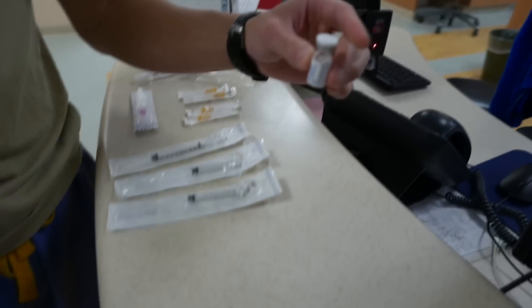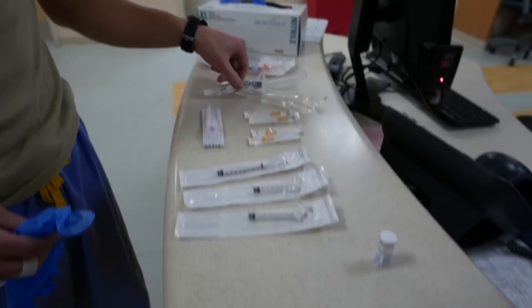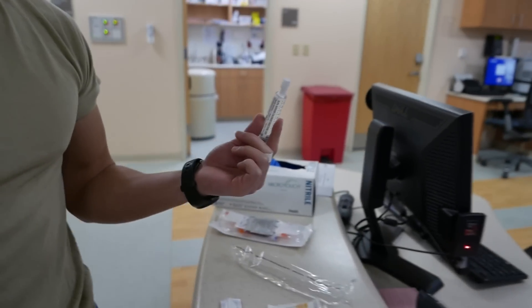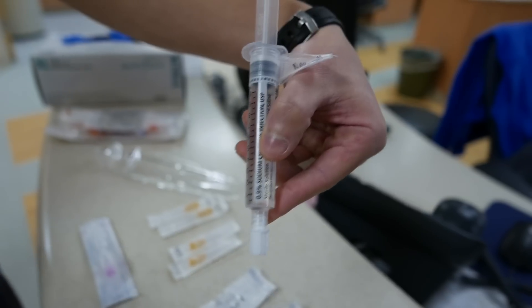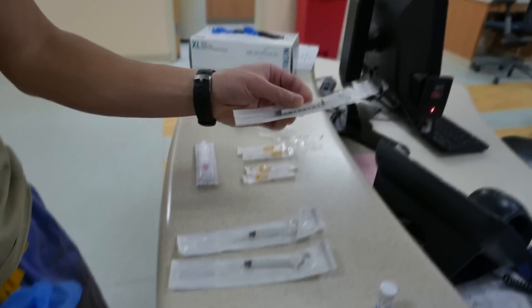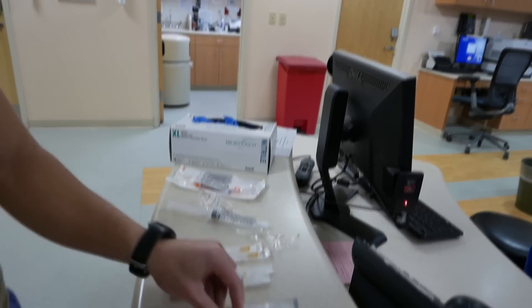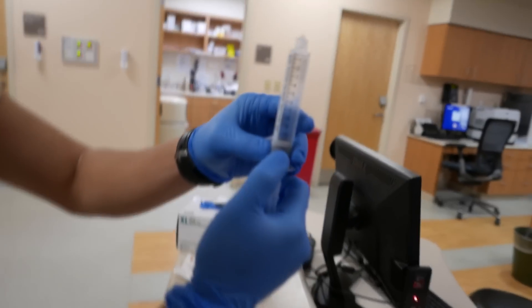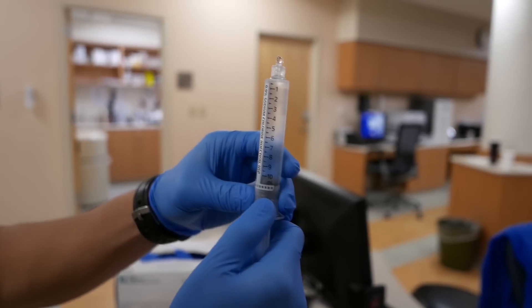One cc in this total, so we're going to drop half a cc and put it into 9.5 mils in here. And that's just a saline flush? Yeah, just a saline flush. And I've also pre-labeled our one cc syringes. So you have a saline flush, 10 cc — you're going to push out 0.5 because we're going to dilute this.